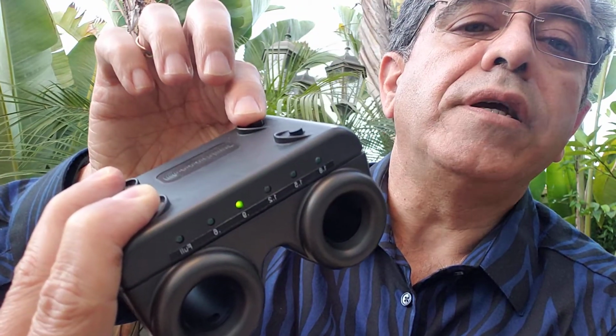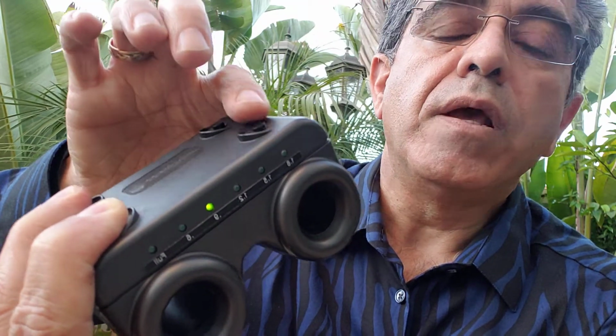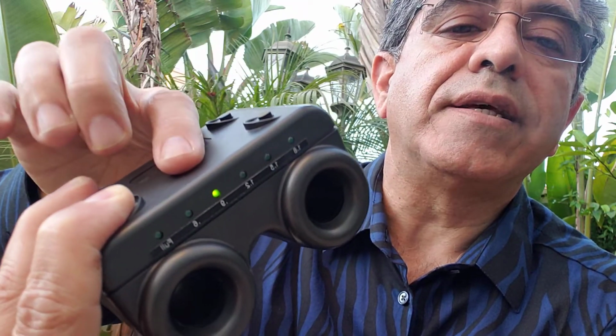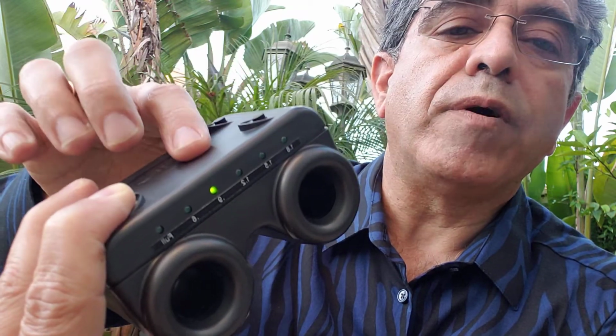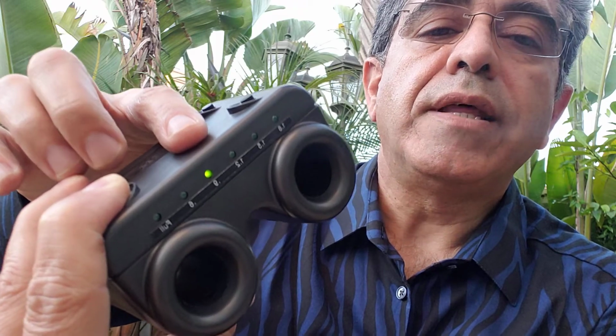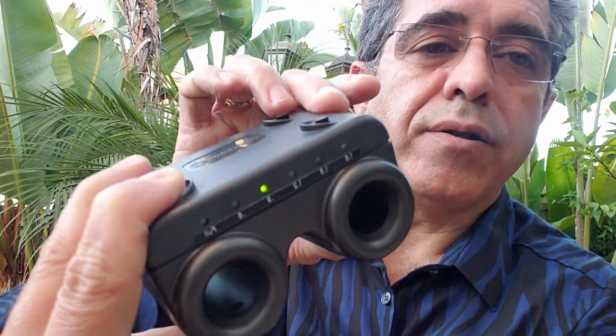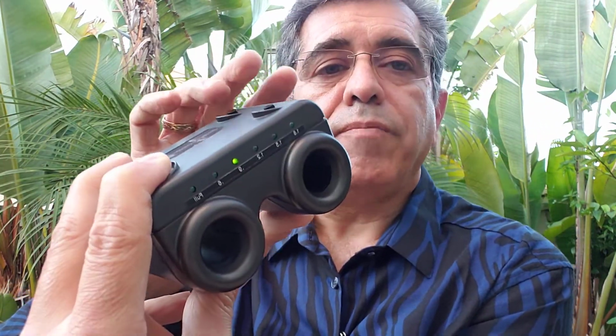These are the same levels as neutral density filters, and you can actually keep going until you find the right level. So once you have decided this is the correct level where there is no APD present, then you can record it on the patient's chart. For example, in this case, it would be 0.9 log units of APD.